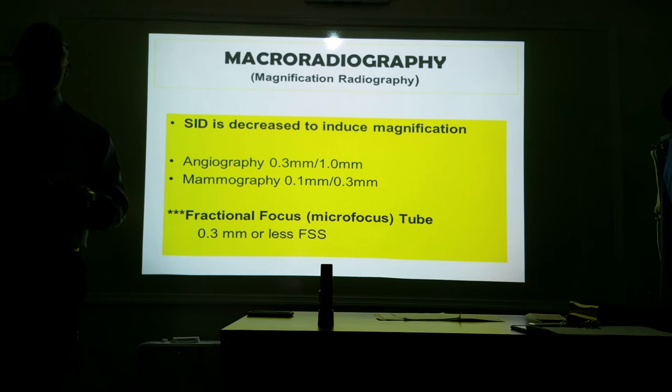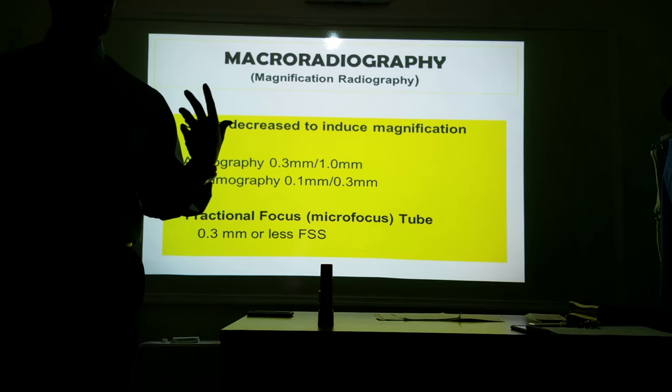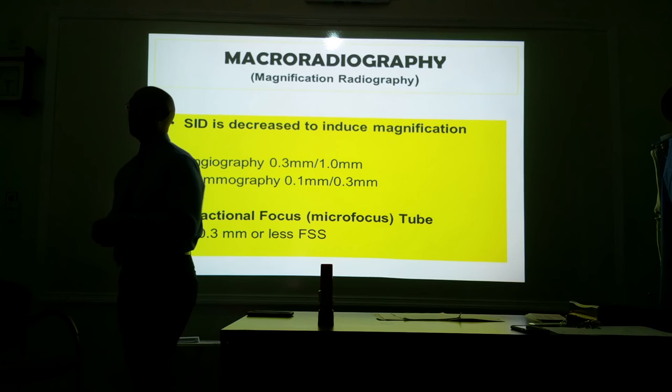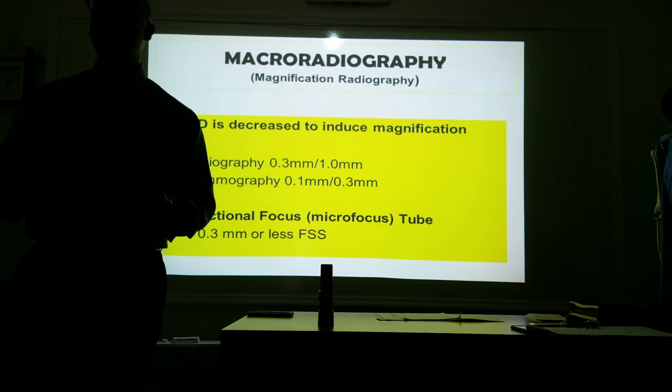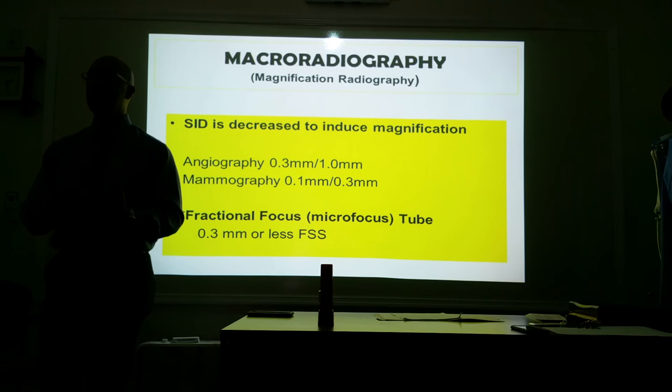Macroradiography. All macroradiography is magnification radiography. There are times when we purposely blow up the image. We make the image larger. But what do we know about making something larger? What's going to happen to our image? We're going to lose detail. Okay? But we want to blow it up. So to compensate for that loss of detail, what you want to do is use the smallest focal spot size possible.